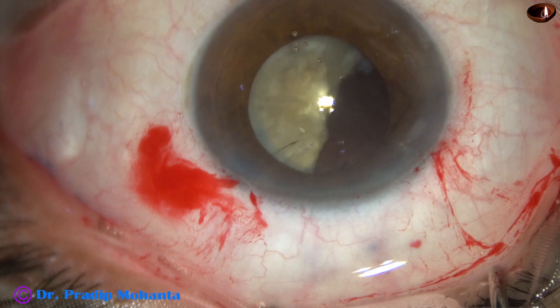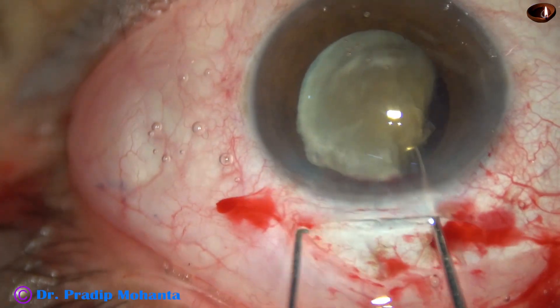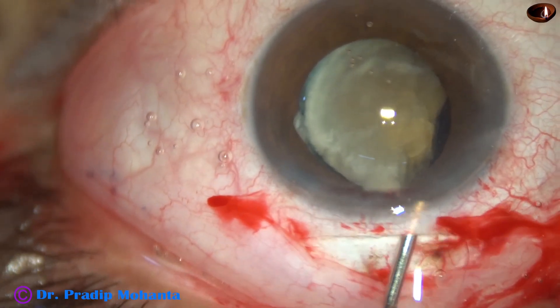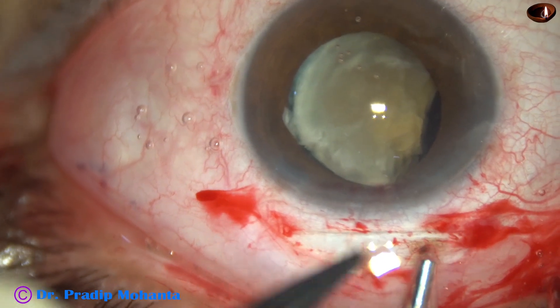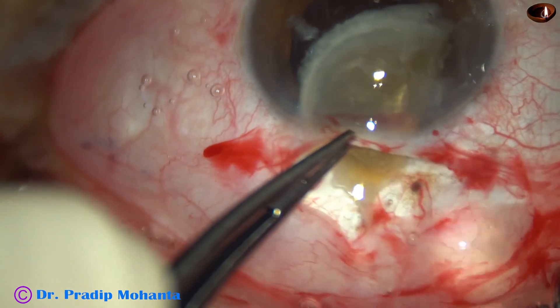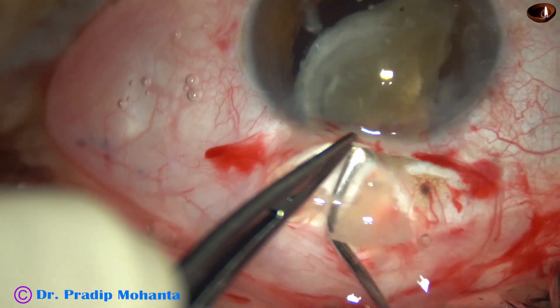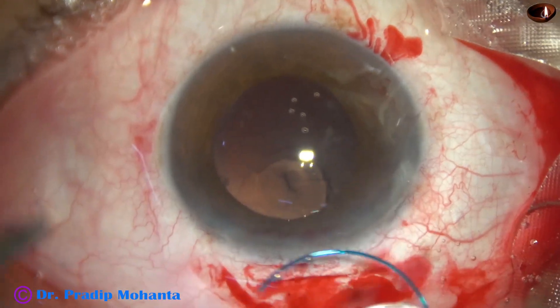This is the last case of this presentation. A posterior capsular rent has occurred and a hemi-nucleus is still remaining. So I convert to SICS, make the tunnel, and inject viscoelastic on either side and try to do visco expression. Viscoelastic is placed on both the right side and left side of the nucleus — press the posterior wall and the nucleus comes out. Visco expression was done for the hemi-nucleus.